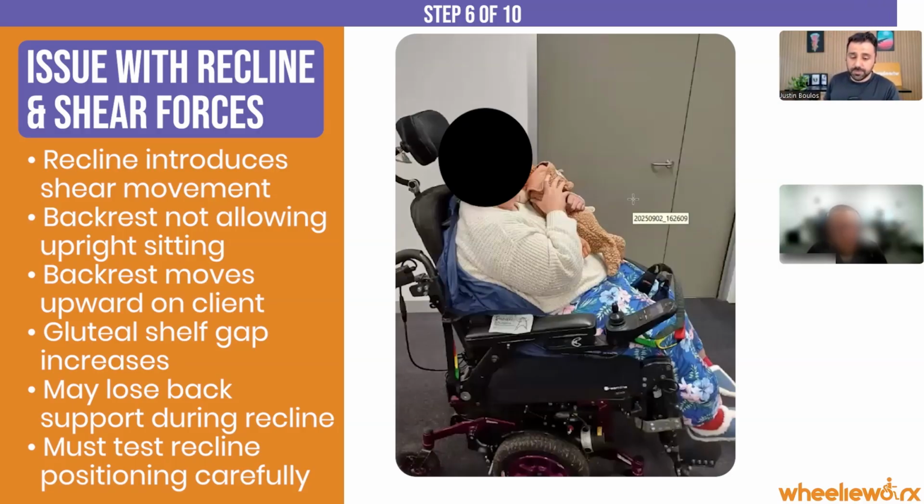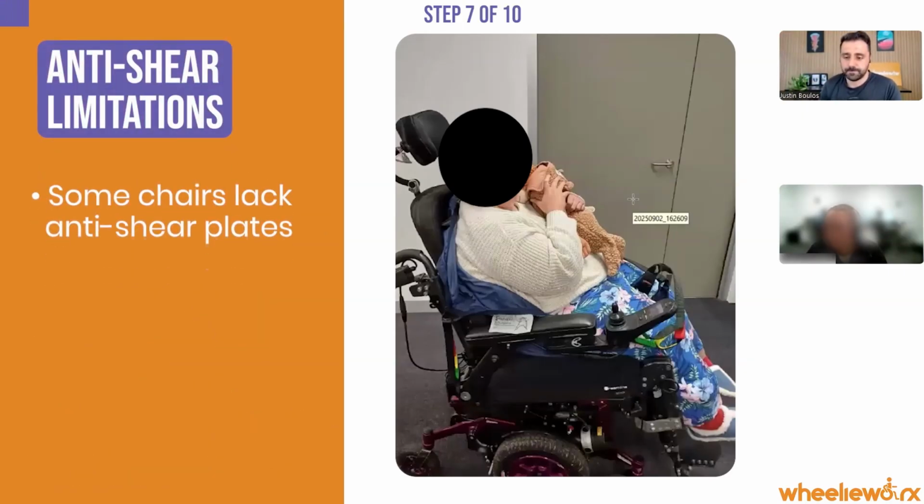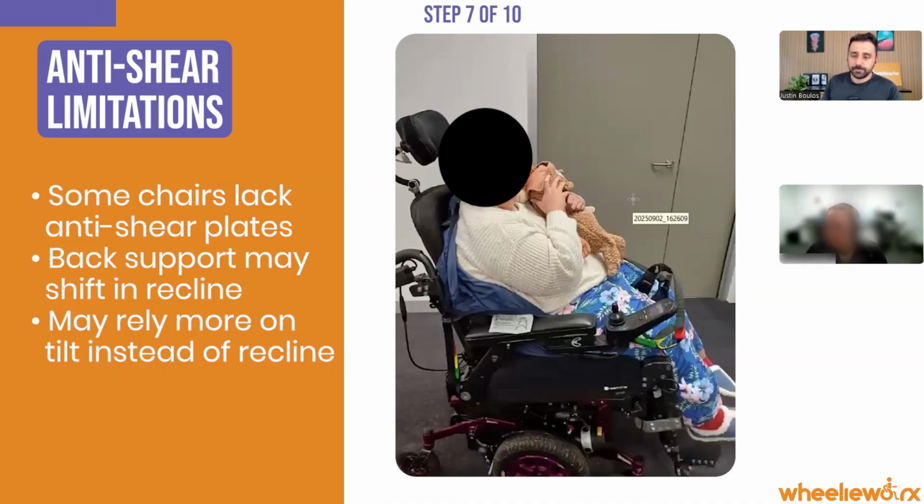And if we can't do that through this chair, then you might need to explore another chair that does have anti-shear characteristics. Or just not utilize as much recline. Just have it as a fixed seat-to-back angle, and for that reason not use recline. Use tilt more. Okay, she doesn't use recline too much currently, but obviously it's a progressive condition, so we're expecting change. And we're sitting at this kind of precipice of change in function at the moment, which makes it hard as well.